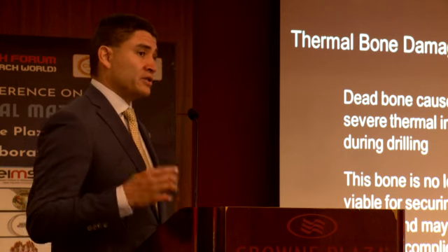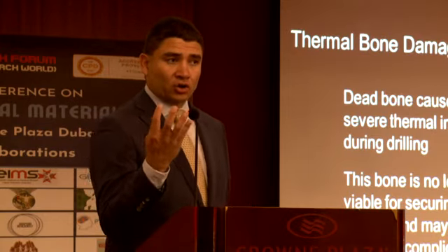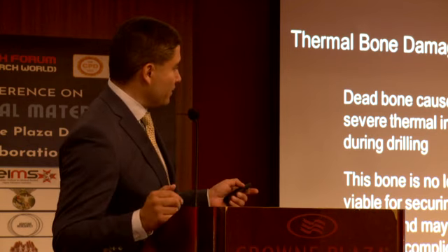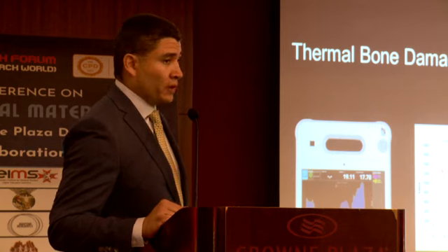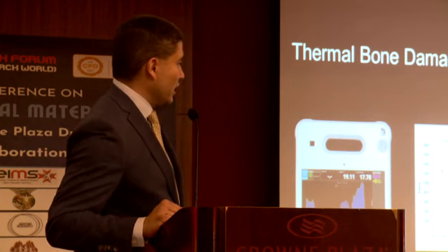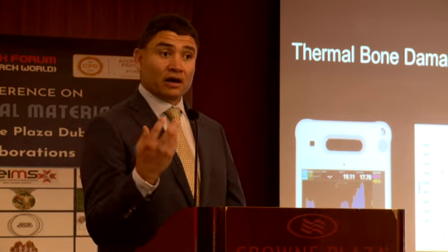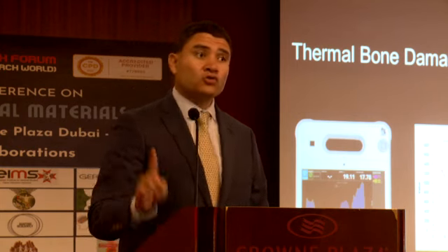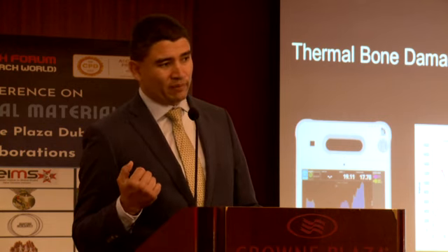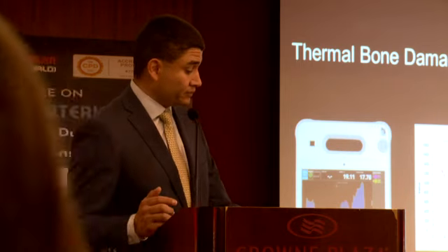Because we know that a ring sequestrum is overheating of cells that have been displaced and burned around it and killed. Those osteoblasts, those bone cells, have been killed around the osteotomy. Now, in orthopedics, we have some thermocouples that, if we place in the bone, we can calculate the amount of heat that is generated around the drilling site. But unfortunately, we don't have that technology for the mouth. So we don't know if we are burning the bone or not.